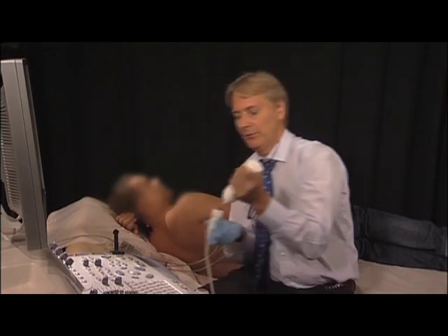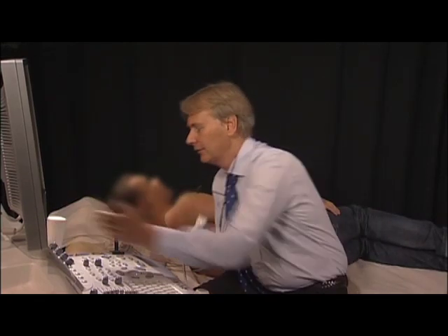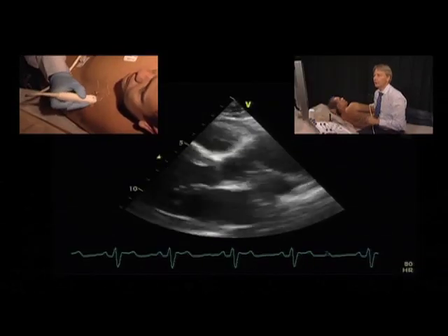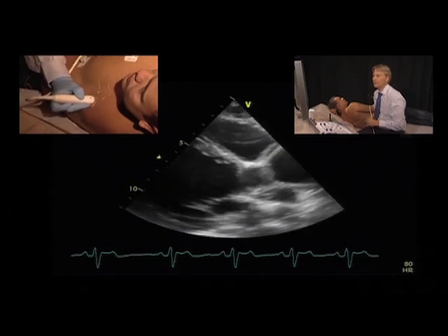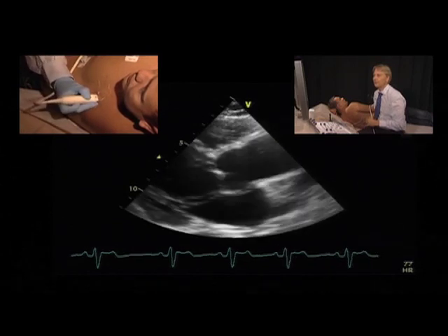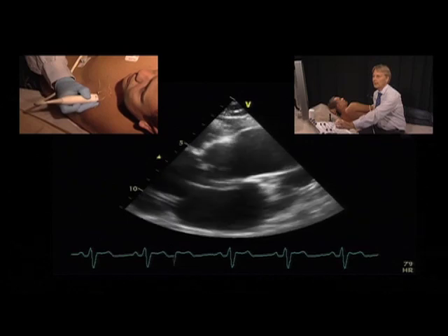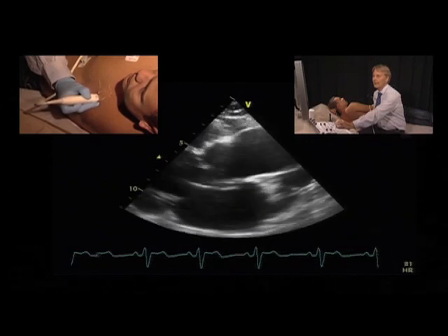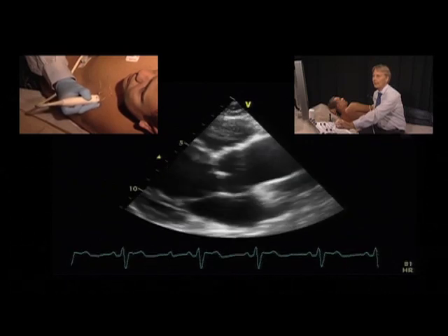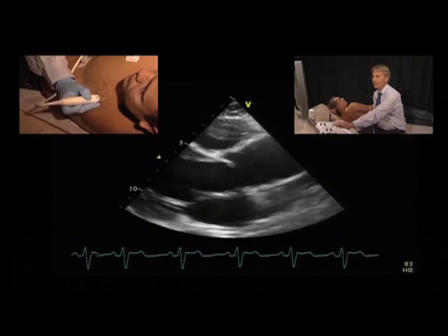Let's take a look at this patient with respect to his aortic valve. We will start with the parasternal long axis view. We can appreciate that the patient has a mildly thickened aortic valve, but there are no calcifications.